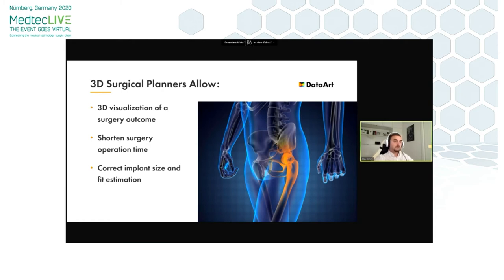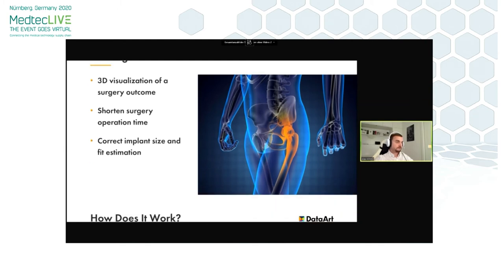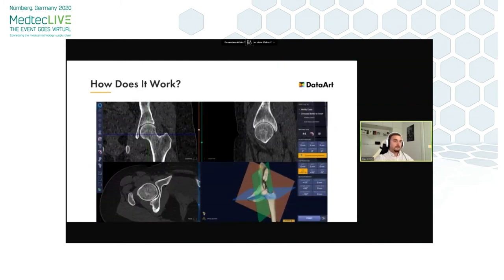Let me show you how it works — an example of a planner that we at Data Art designed and built for our client. This is the 3D planner for hip resurfacing with ceramic-on-ceramic implants. As input information, we have a CT scan of a joint and a segmented 3D model produced from this particular scan, matched in the same coordinate system.